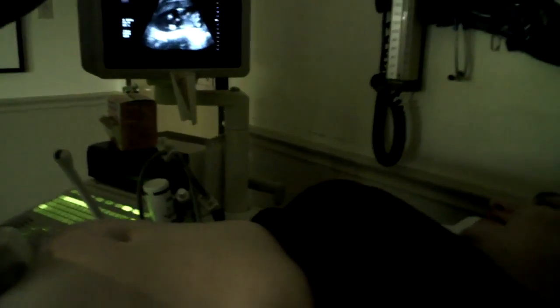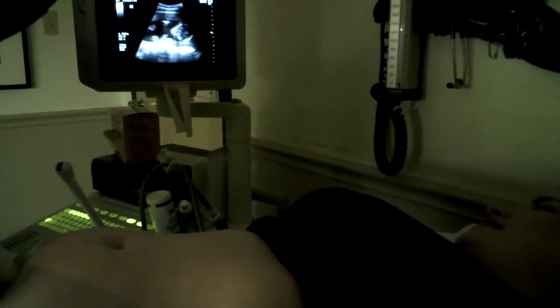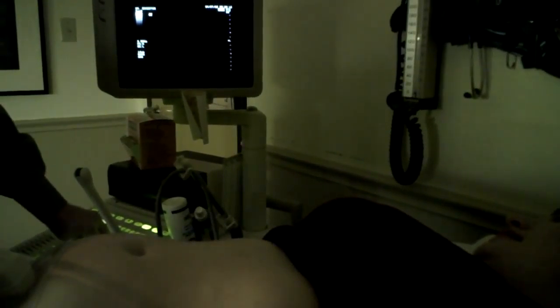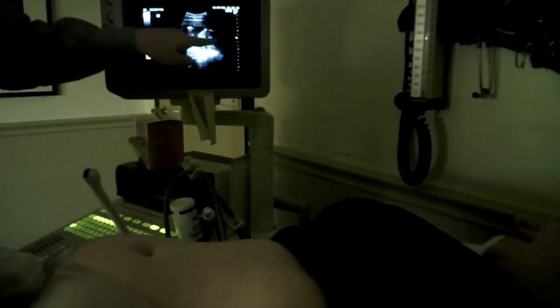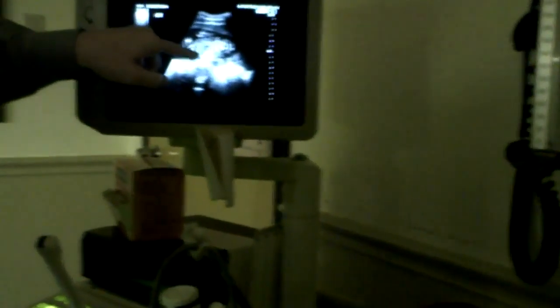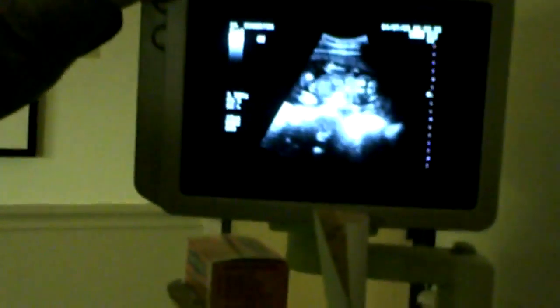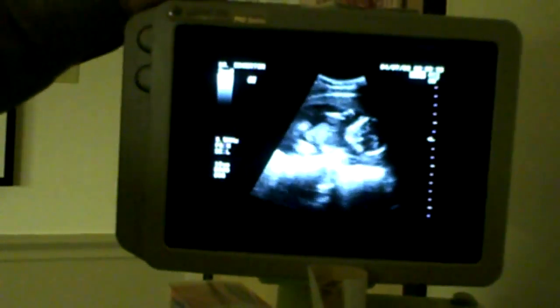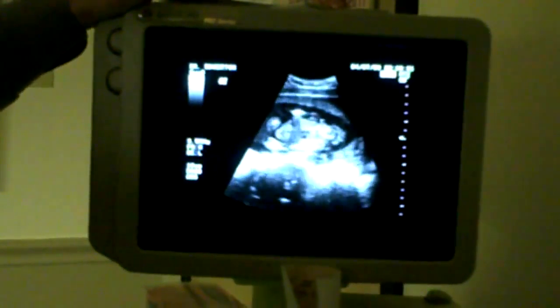Let's see if this baby's going to cooperate for us. Here's the head of the baby, there's our heart beating, you see baby moving around. We're going to get to see the heartbeat on this visit and you'll see more on your next.